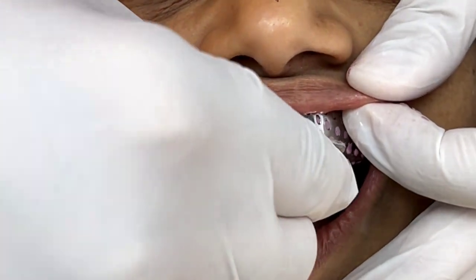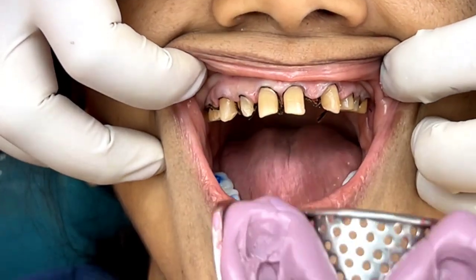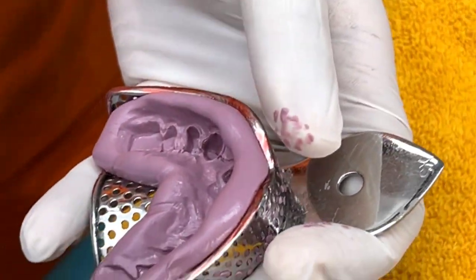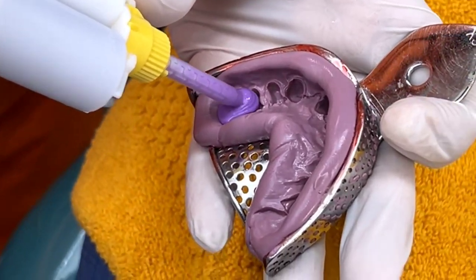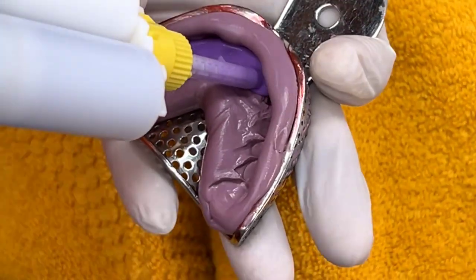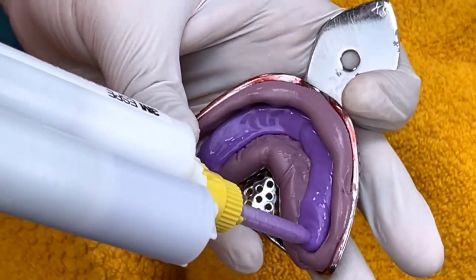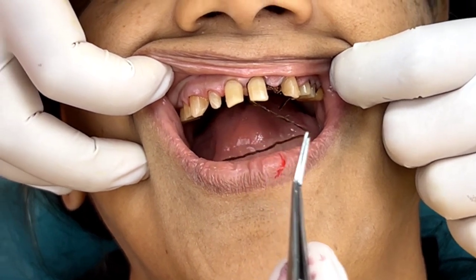The tray is tweaked, as you just saw in the video, and before the putty polymerizes it is retrieved from the patient's mouth. This putty is now a scaffold for the light body — it's like a custom tray in putty. Because I have fidgeted the tray and moved it a little, a small amount of space is created within which the light body goes and finds position to give a very accurate impression.